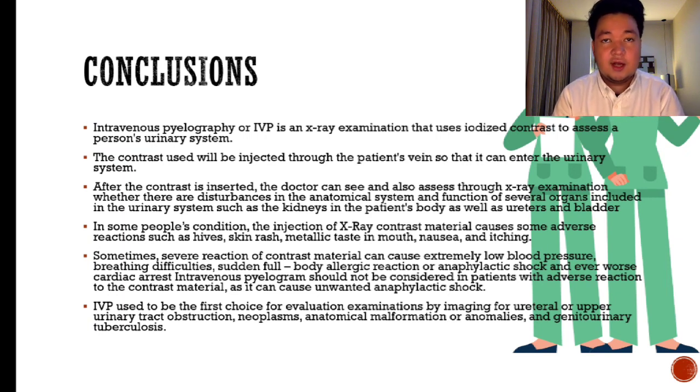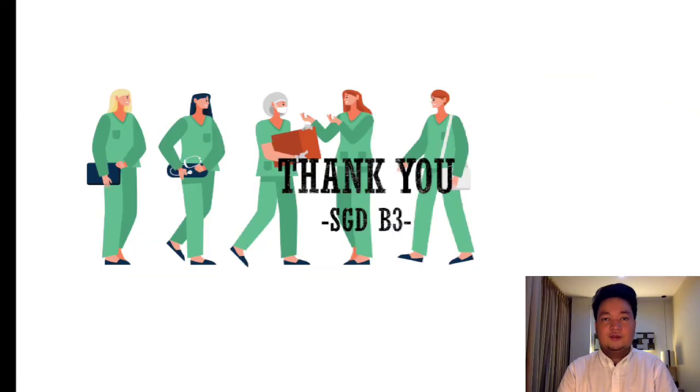In some people, the IVP could cause some adverse reactions, such as hives, skin rash, metallic taste in the mouth, nausea, and itching. Sometimes, a severe reaction to the contrast material can cause extremely low blood pressure, breathing difficulty, sudden full body allergic reaction, or anaphylactic shock, and even worse, cardiac arrest. Intravenous pyelography should not be considered in patients with an adverse reaction to the contrast material, as it can cause unwanted anaphylactic shock. IVP used to be the first choice for evaluation and examination, but it is safe with proper supervision.